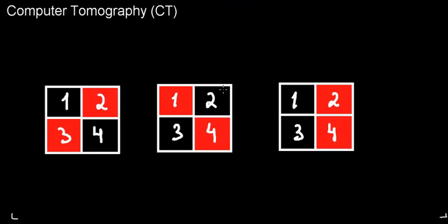And inside these three different cubes, I have black squares, which don't contain any dense material, and the red squares that contain very dense material. And I can't see inside the squares, and I want to figure out what is the configuration of this dense material. So I'm looking at the square from the outside, and I have no idea what it contains. What I can do is radiate it, and I can put a detector on the other side and see if I detected absorption.